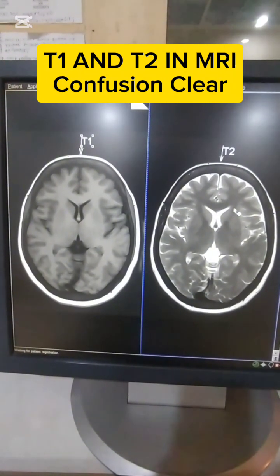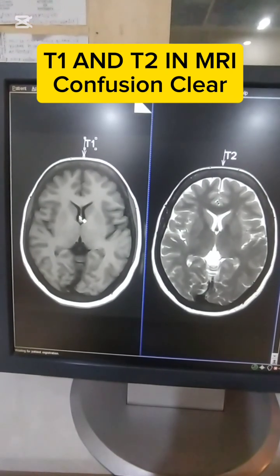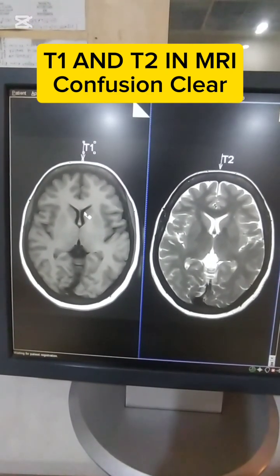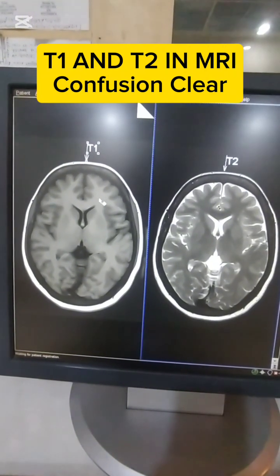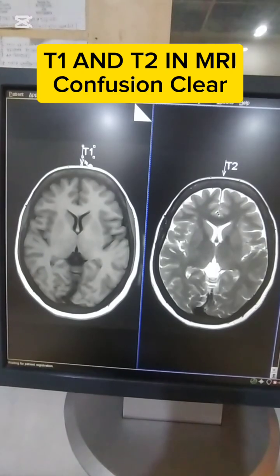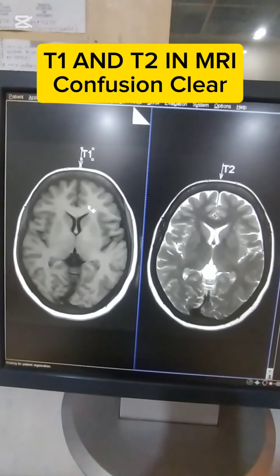Now, the difference between the two relaxation processes gives the difference in contrast between the tissues. I repeat, the difference between the two relaxation processes in a tissue or in different tissues. Suppose the CSF and the white matter are two types of tissue, but these two types of tissue have different T1 weighted signals. So at a particular time, we can differentiate between the white matter and CSF.